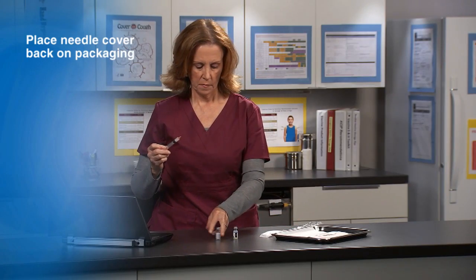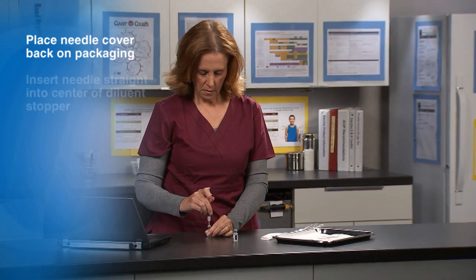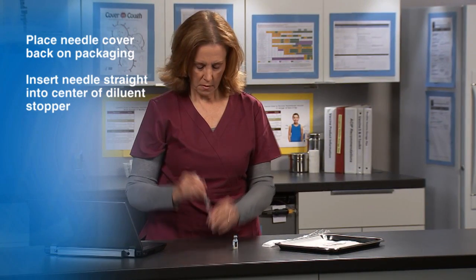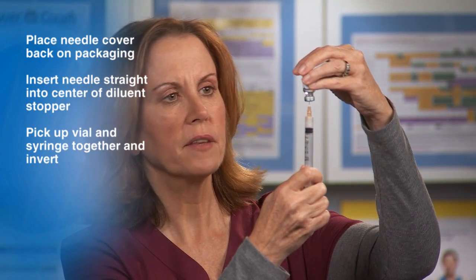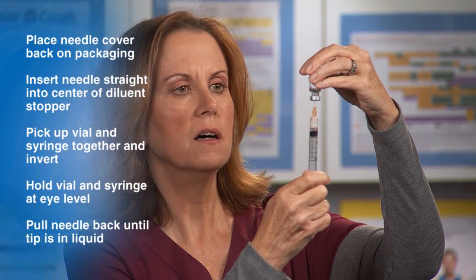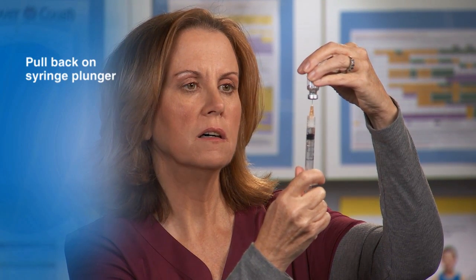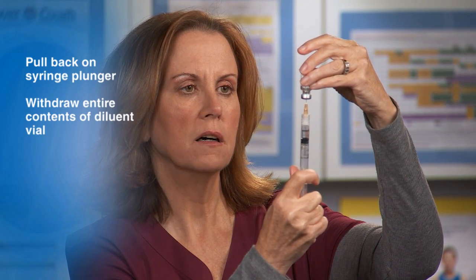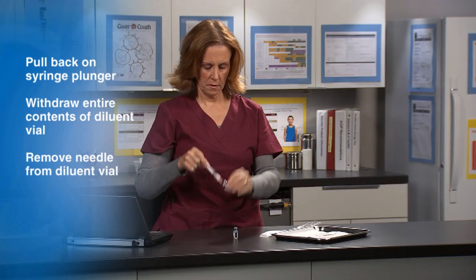Hold the diluent vial on the counter with your non-dominant hand. Holding the syringe with your dominant hand, insert the needle straight into the center of the diluent vial stopper. Pick up the vial and syringe together, then invert them. Hold the vial and syringe at eye level and carefully pull the needle back until the tip is in the liquid. Then pull back on the plunger of the syringe, making sure to withdraw the entire contents of the diluent vial.